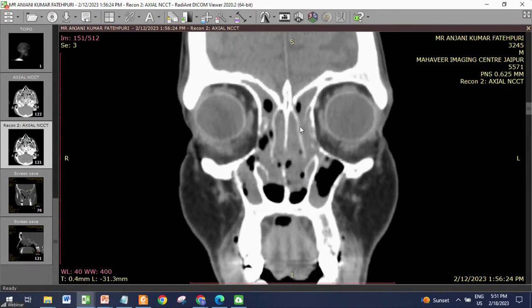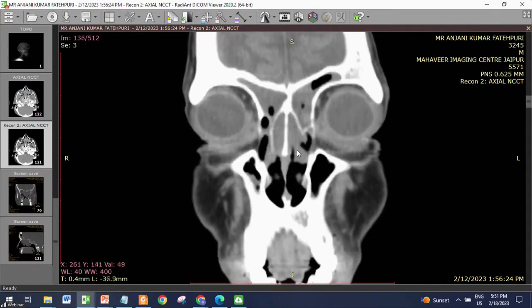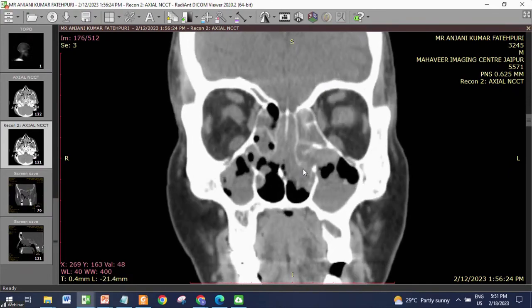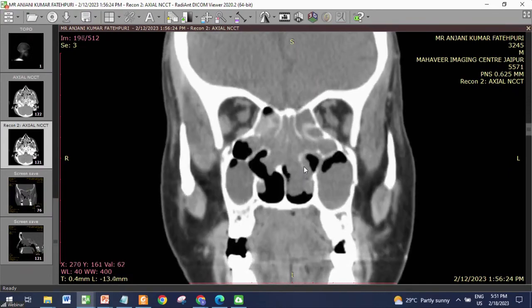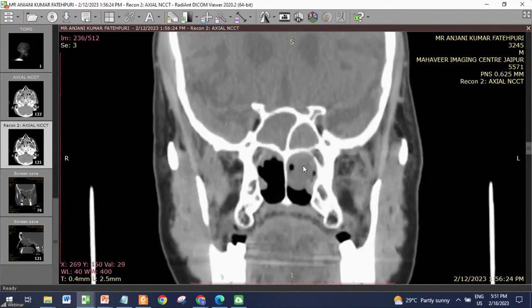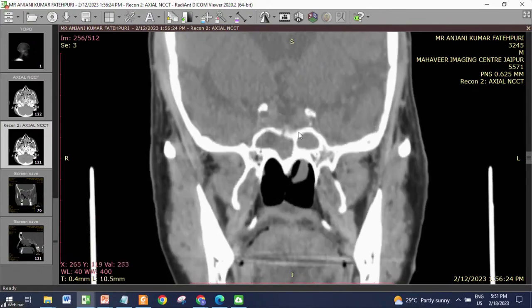Yes, sir. That is something. Once you have a disease medial to the turbinate, you have to resect it partially to give access to the topicals to reach inside the olfactory region and other areas. So this is one. Number two, see, almost white out. I can see optic nerve all in place.